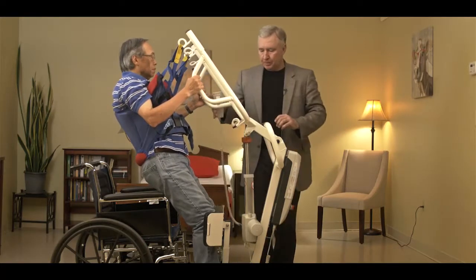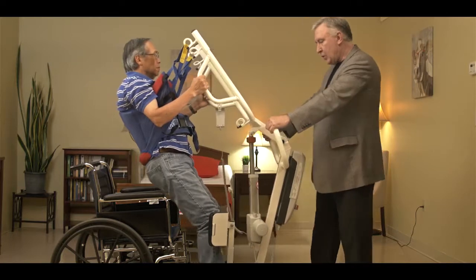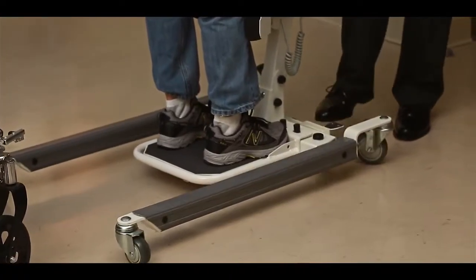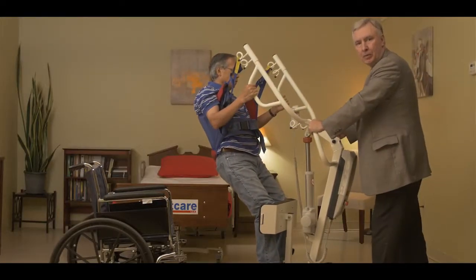Once we're in a comfortable position, unlock the casters, take the lift away from the wheelchair, close the base, and now transfer the patient to another seated position.